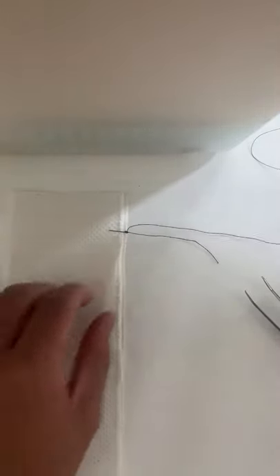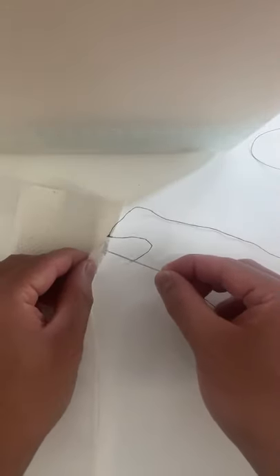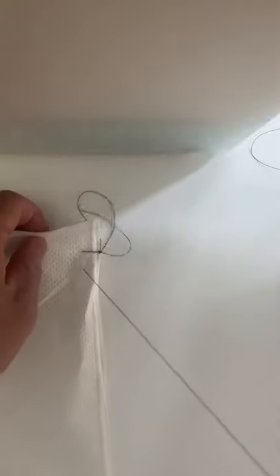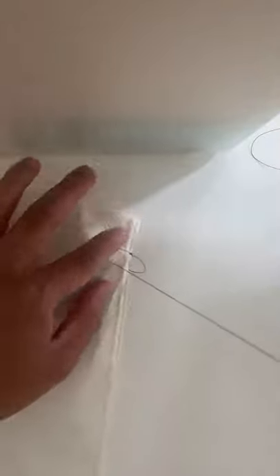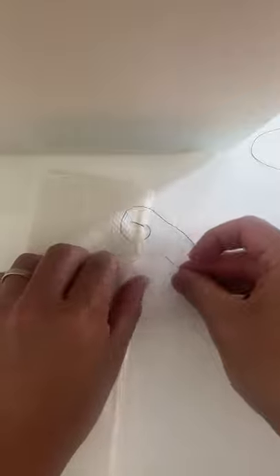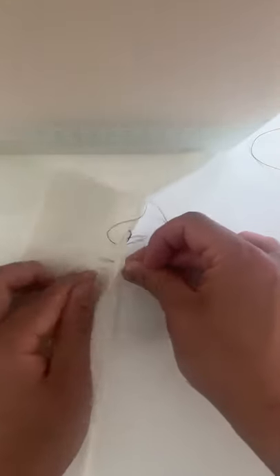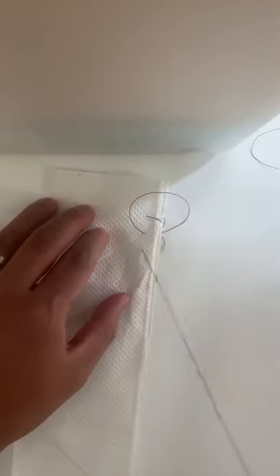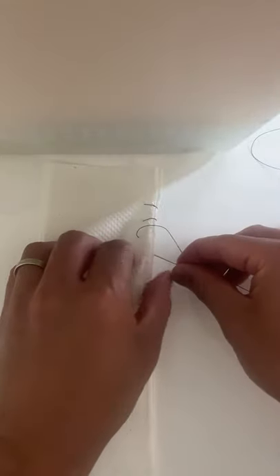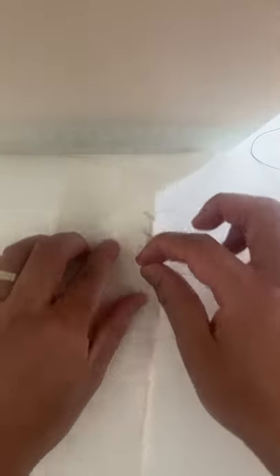So we're going to go ahead and insert our needle from the back end — so from behind — and go through both layers of the tissue and pull through. Then we're going to repeat at about the same distance and do that again: come from behind and pull through. Then repeat it again from behind, the same distance apart, and pull through.